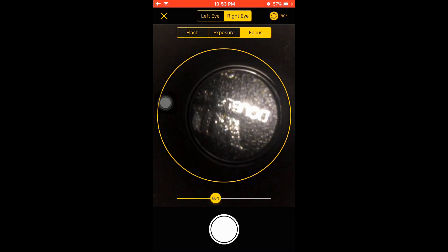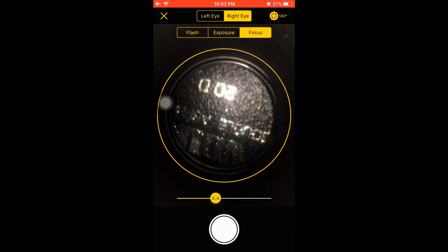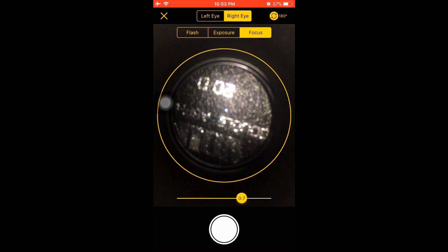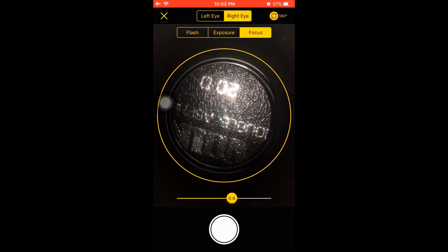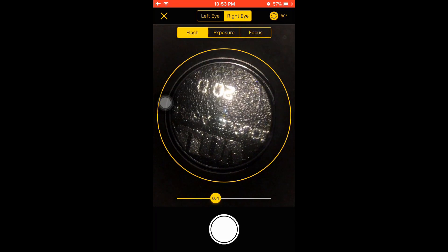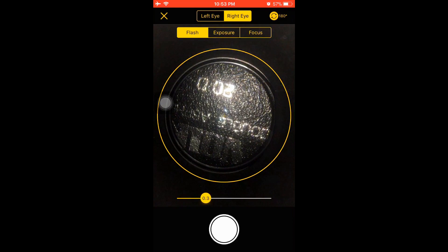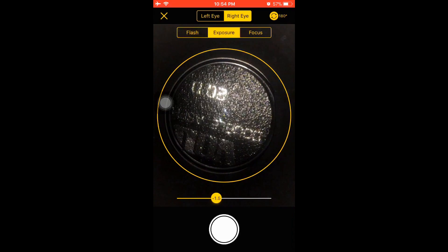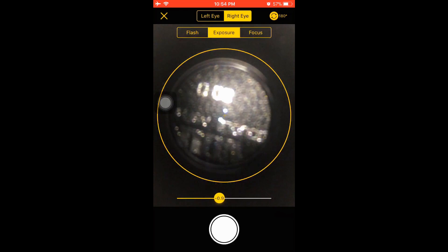The image is aligned and centered using the circular guide. An additional feature of the iOS app is a manual focusing slider which can help in adjusting the focus. One can also touch-focus if required. There is also control over the flash intensity so that if the patient finds the flash too bright, one can reduce the flash intensity. As in the Android app, there is also a control for the exposure.